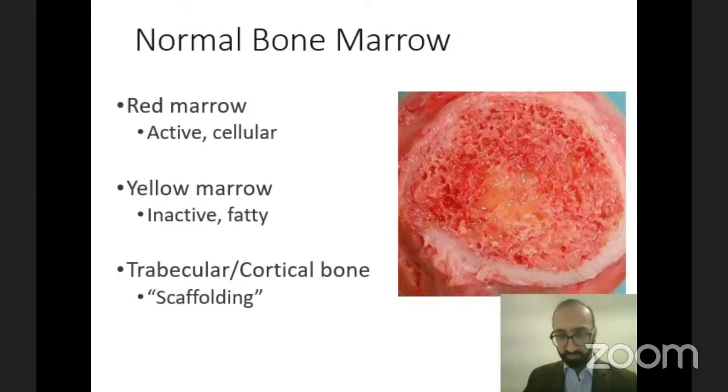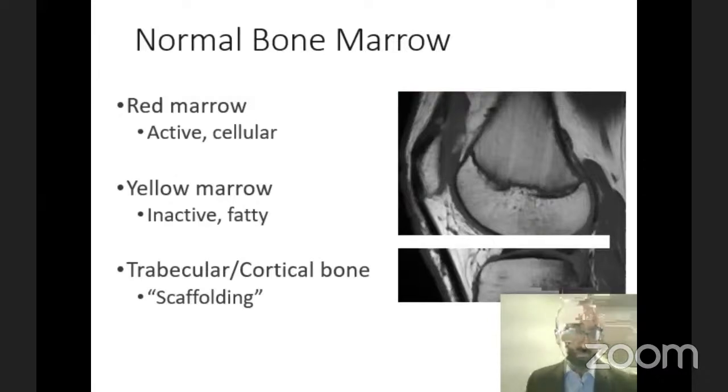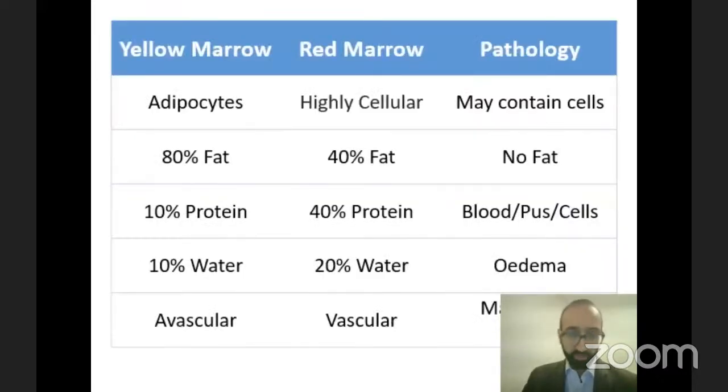And you can see a little bit of both in this cut-through image of the femoral head. The trabecular bone is very difficult to see on MRI. That's the purpose of that image. You can just about make some kind of bony architecture out in the epiphysis there, but that is something difficult, and it's not the purpose of the talk right now.